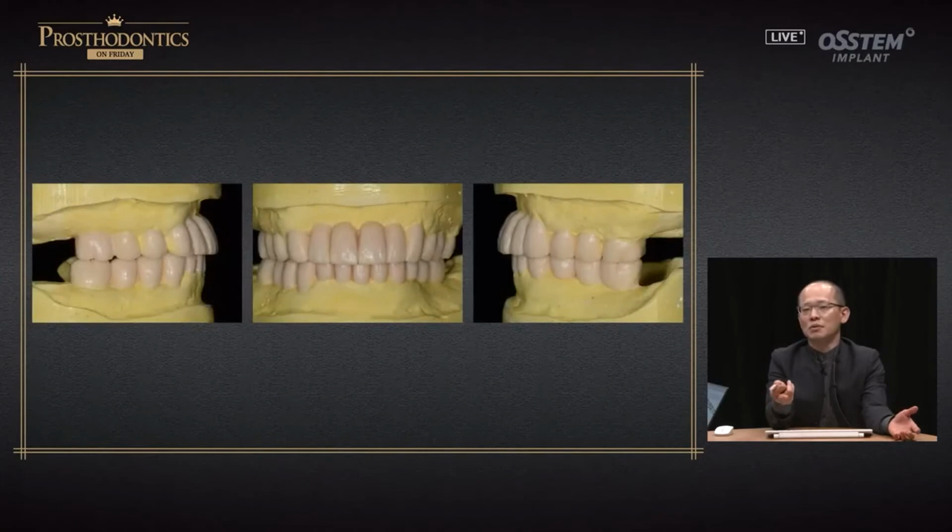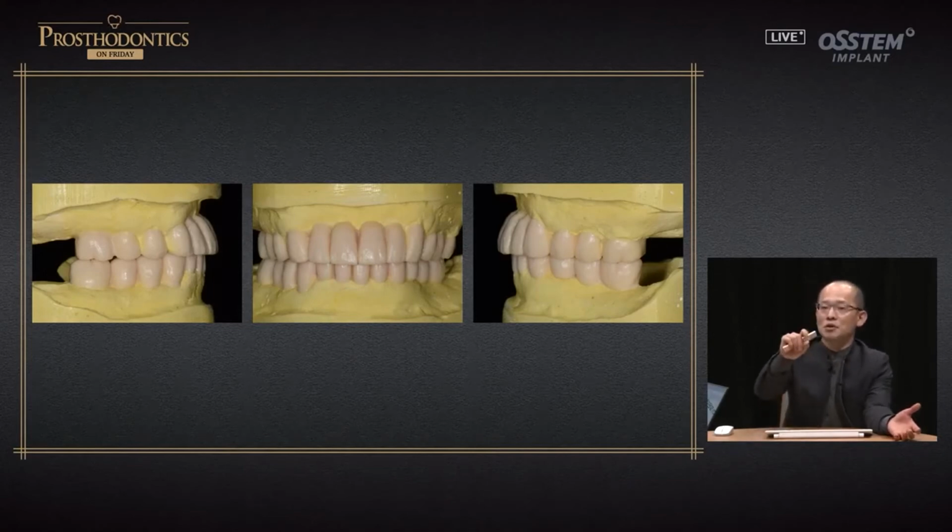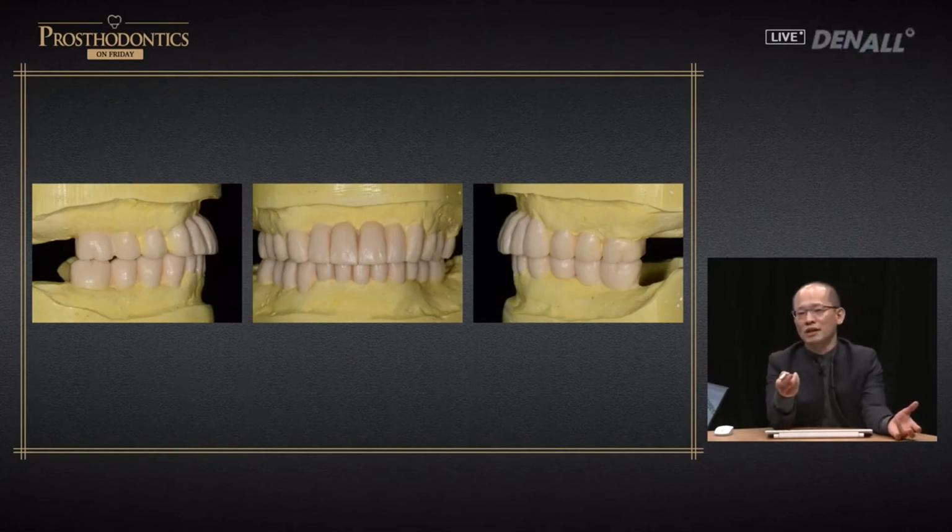So this is a very textbook procedure. VD and occlusal plane are assessed. In the case of VD, on the occlusal side, rather than looking at the space aesthetically, you check whether there is a sufficient profile, and in the diagnostics, VD and occlusal plane are assessed. In the final restoration, you have to recheck again.